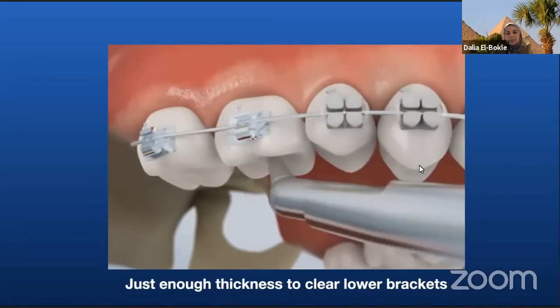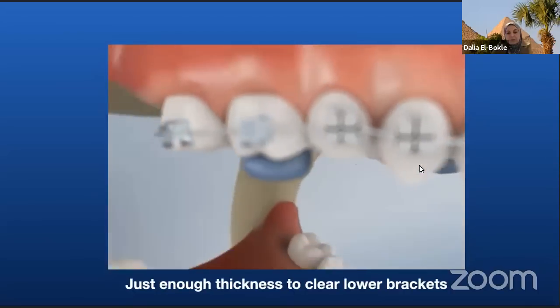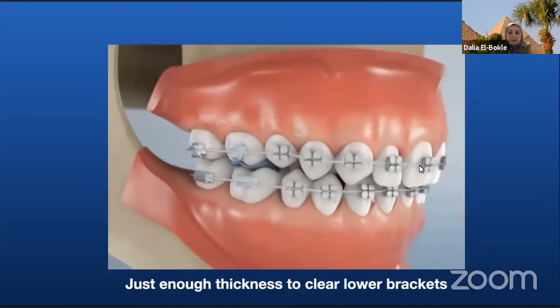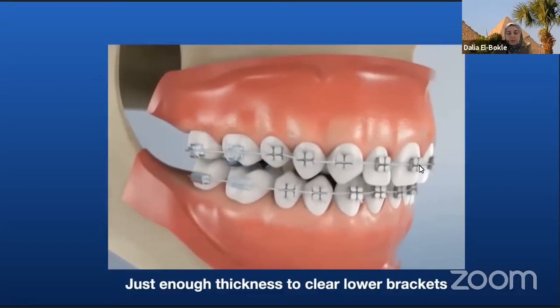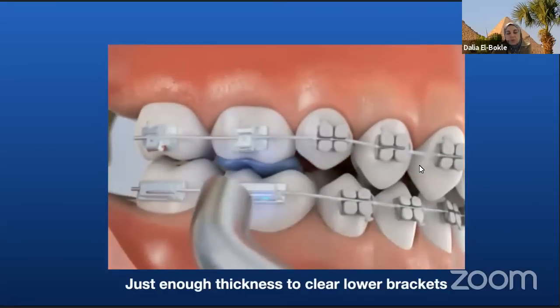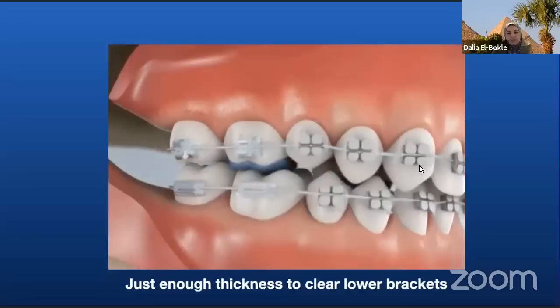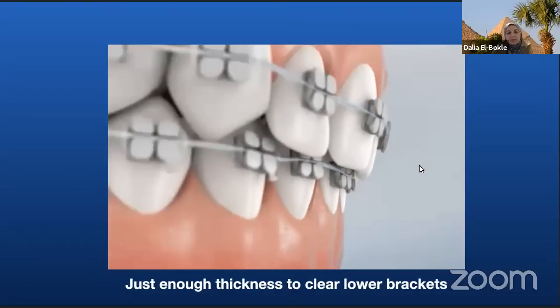Again, another tip is to use just enough thickness to clear the lower brackets. Don't use too much, so that the patient doesn't have a lot of discomfort. And here you can always ask the patient to bite. And you always have to adjust it in order to prevent breakage when the patient bites and chews on the bite turbos. You can easily do that with the use of articulating paper to make sure there is no prematurity on lateral excursions.